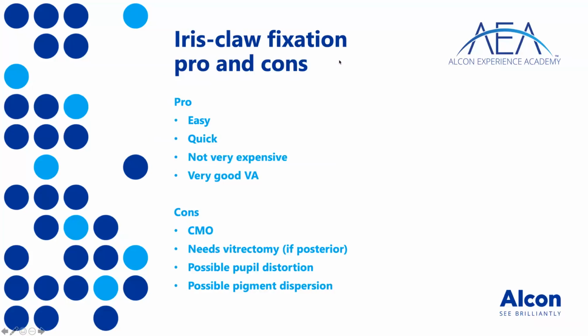So what are the advantages? It's easy. Anybody can do it. And when I say anybody, I mean it, because I always and only use it posteriorly. But lots of colleagues of mine, including 2 VR surgeons in the same place where I work, use it anteriorly. You can put it easily anteriorly, and there are instruments called VacuFix that you use to suck the iris up into the lens to claw it. It's very, very easy to do.